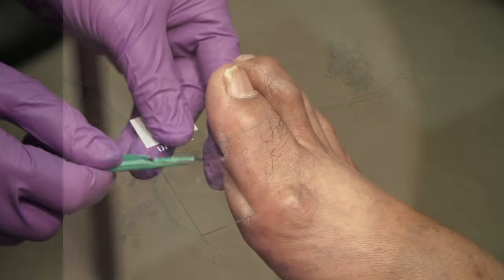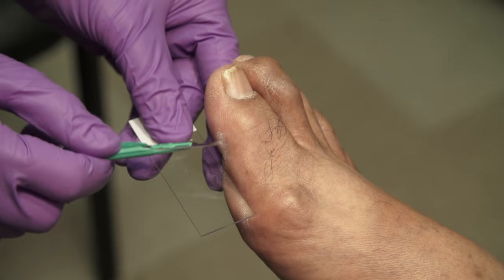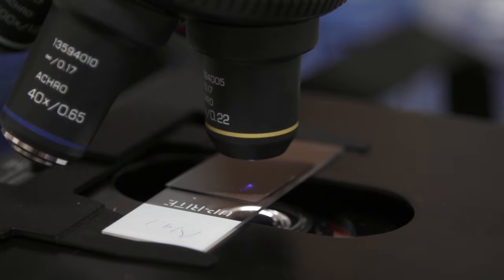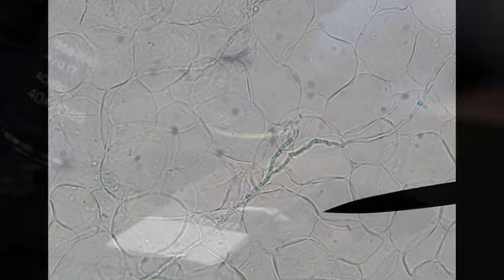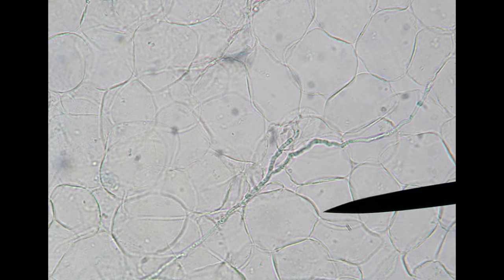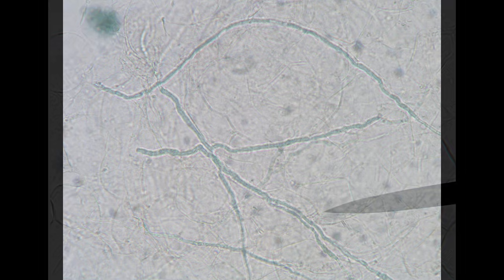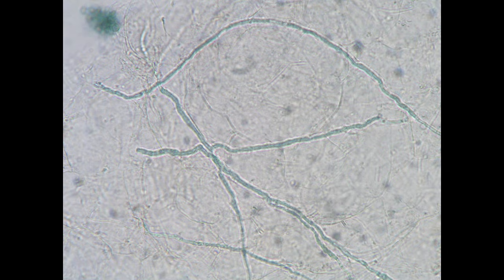False negatives occur when the scraping is inadequate or the clinician does not look at sufficient low-power fields to screen the slide. See how the fungal stain helps the fungal elements stand out from the human cells and therefore increases the sensitivity of the preparation.